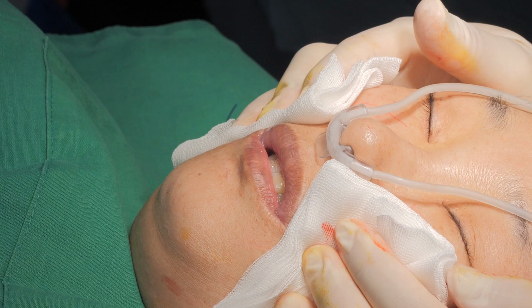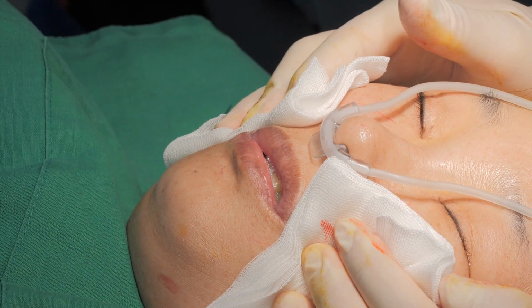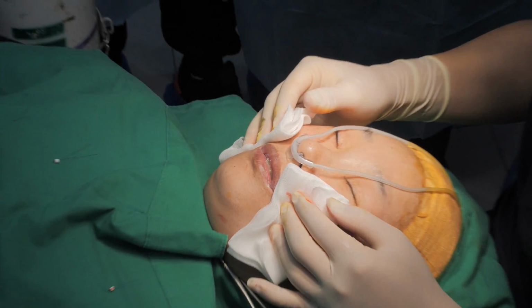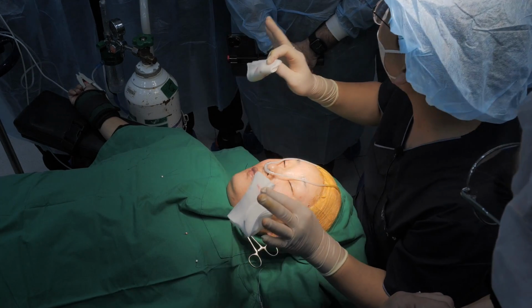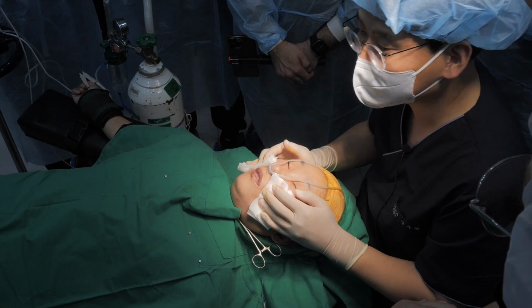Do you massage after, or is that it? Massage for what? Downward, to restore the dimpling. No, I do not apply massage. I just restore the dimpling. That's all. Don't apply massage. It will release the anchoring. You must not.